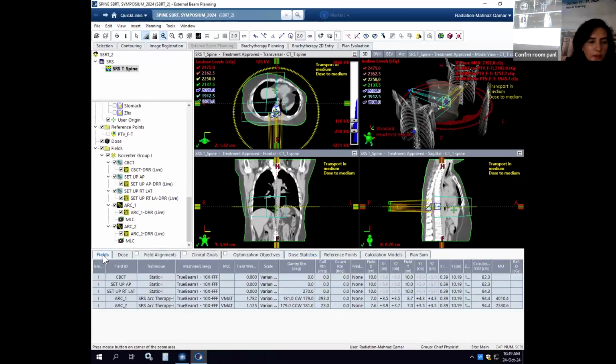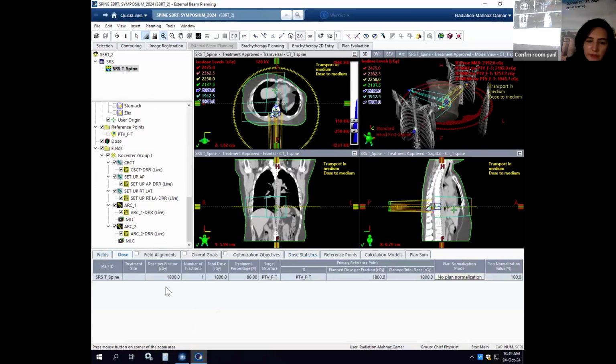Most of our treatments are delivered at 18 gray single fraction and to the 80% isodose line. And sorry, I forgot to mention the prescription line that we start with is 80%, and usually with linac SBRT, the isodose line prescribed to is 80 to 90%. Sometimes we go down to about 79% when we need a faster, sharper gradient in some cases, and we're unable to achieve our spillage and falloff requirements, but usually we start with an 80% prescription isodose line.